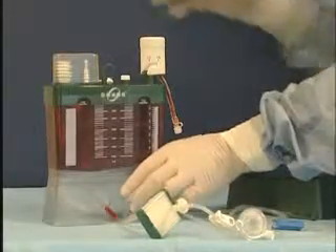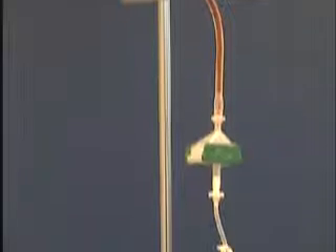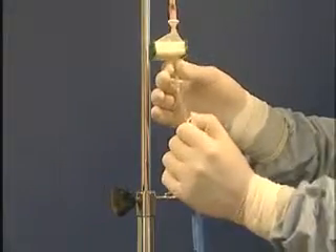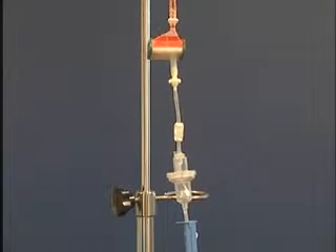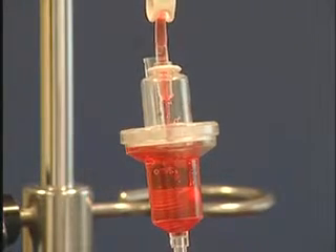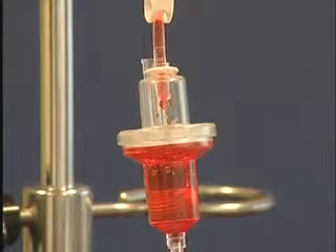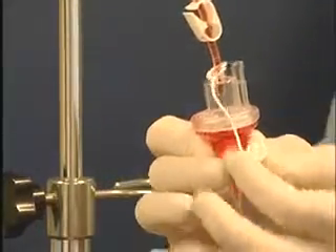By breaking off the breakaway cap, the donor system is vented. We prime the system by opening the white tubing clamp. Once the blood flow into the drip chamber has stopped completely, we tightly place the protective cap on the air vent of the drip chamber.